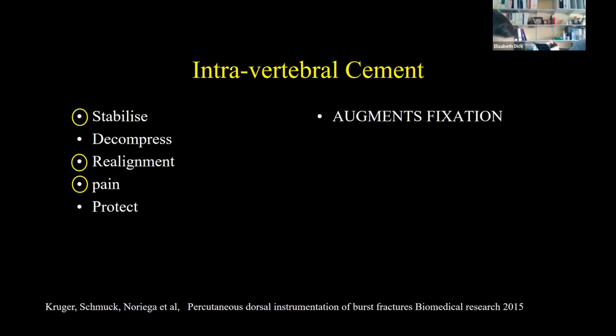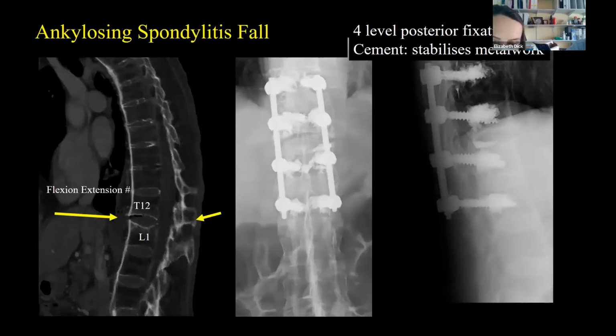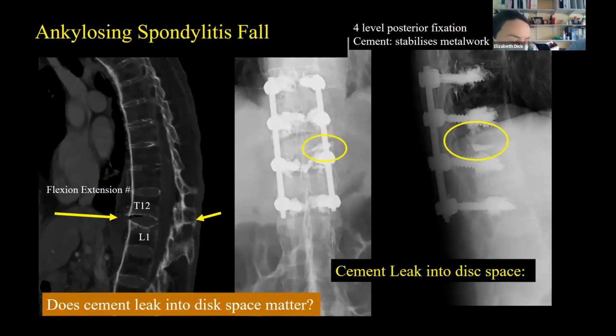I wanted briefly, while we were talking about rigid spines, to talk about cement, which is used to augment the fixation, correct, Reza? So here's an example of a patient with ankylosing spondylitis who has a flexion extension injury and a long posterior fixation. And what I've put this up for is to show the cement around the screws. The aim of that is basically to help, because the patient is very osteopenic, to help the screw fix inside, correct? But the other thing I wanted to draw your attention to with this patient is there's been a little bit of leak into the disc space, which doesn't matter, correct?